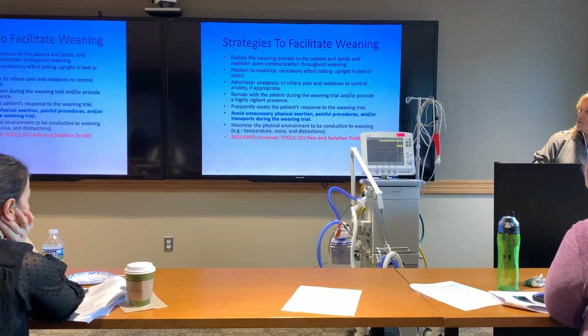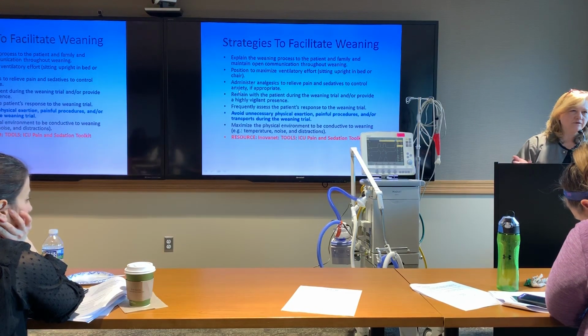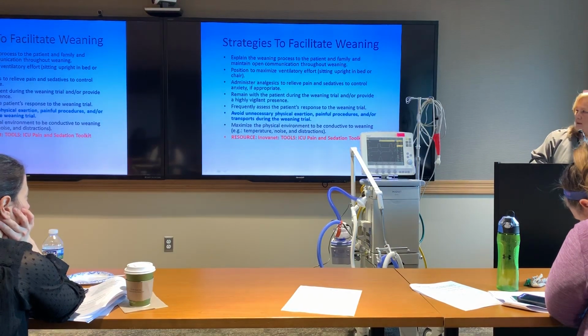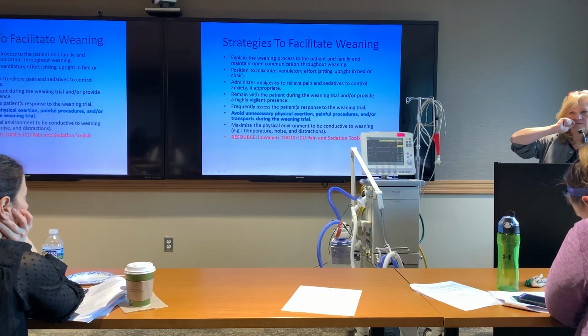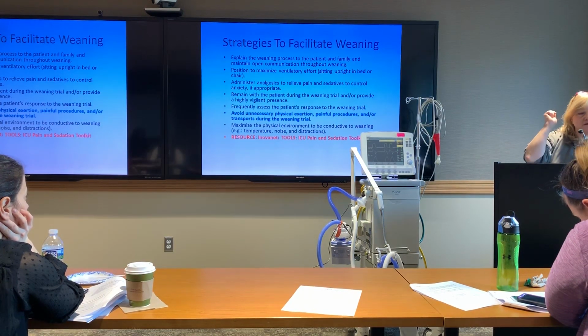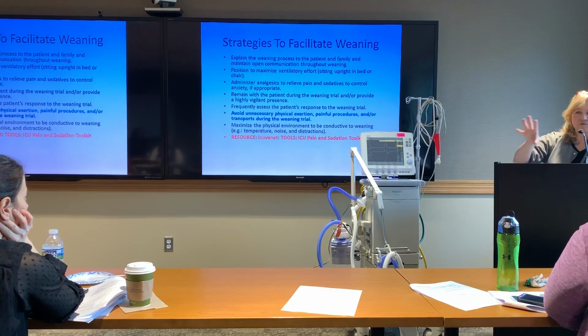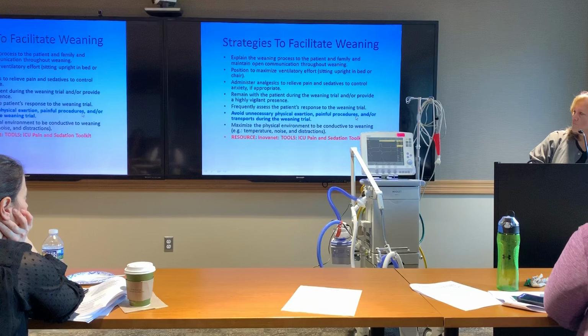You do want to keep pain control appropriately maintained. Our weaning criteria here is to keep the RASS score -1 to 1, somewhere in that range if you're weaning somebody. It's good to keep a vigilant presence, because sometimes they just get tired of breathing through that tube and they will pull their tube out, and then we have to do all that extra paperwork. Okay, so we don't want to do that. I think you guys have the CPAP signs in your unit too, right? Patient on CPAP trials. Even though they're not CPAP trials anymore, it's close enough.